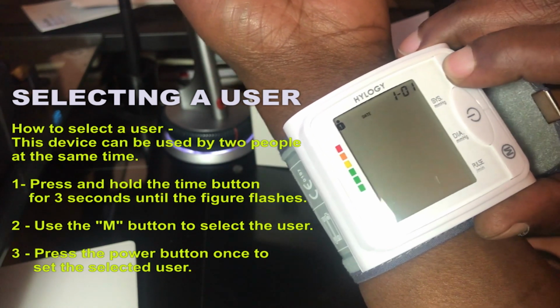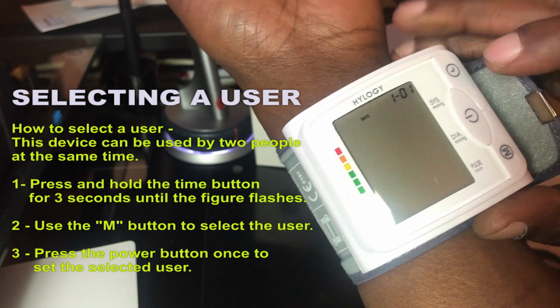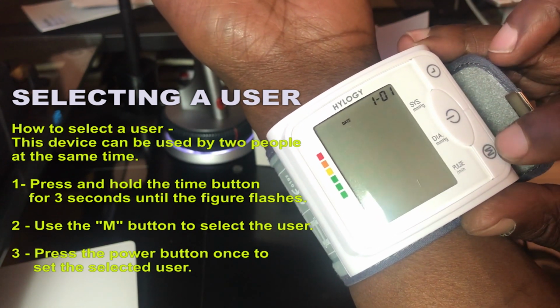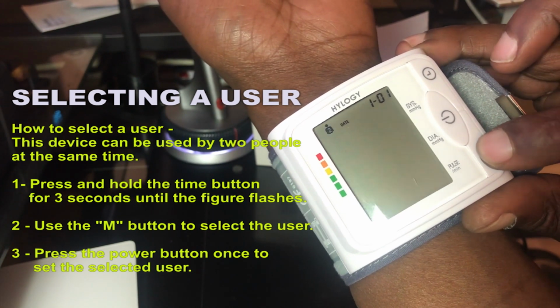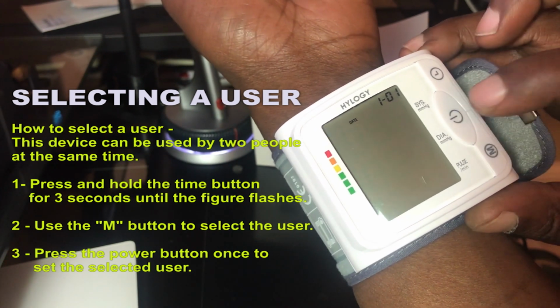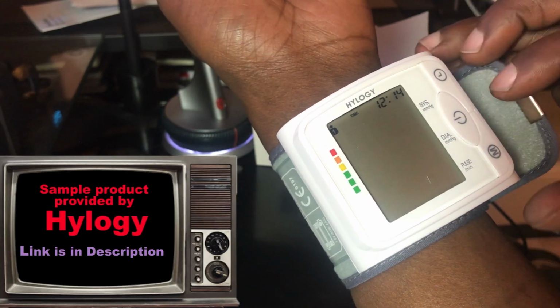So if I press the power button, the time button, the user starts to blink. Then if I press the memory button, I can select which one I want. And once I've selected the one I want, then you just press the power button once and then you're set. So we'll go through that again.